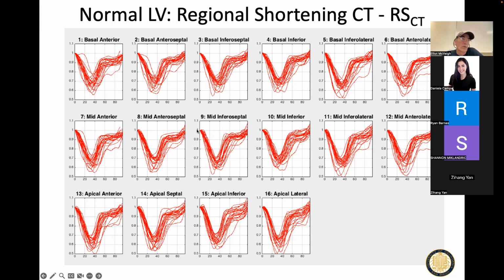It's a 1D strain with no directional sensitivity. So basically, you take the area, it gets smaller, take the square root of that, and say, okay, that's 1D strain as opposed to the reduction in area, and plot that. And so it starts with 1. If it stayed at 1, that would mean that piece of tissue did nothing over time. It just stayed at the same area.